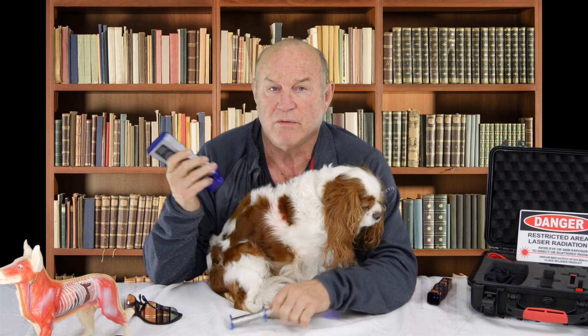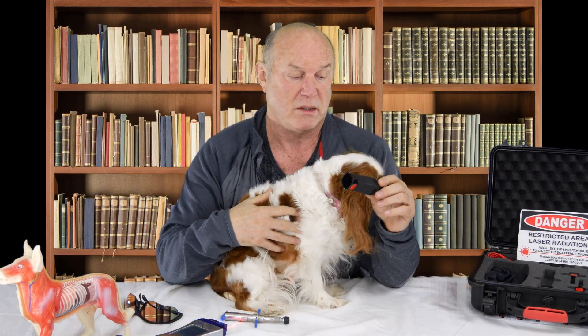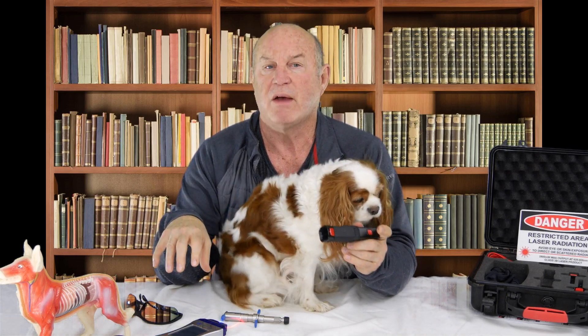That became a reason for us to actually abandon most of our surgeries. The important thing is that this approach basically solves the problem in two to three weeks. If it doesn't, we can always go to surgery — that's essentially the approach we use. We'll utilize this particular instrument, which allows us to deliver — instead of having to program four sets of four, in other words 16 frequencies — we'll just flip this on.